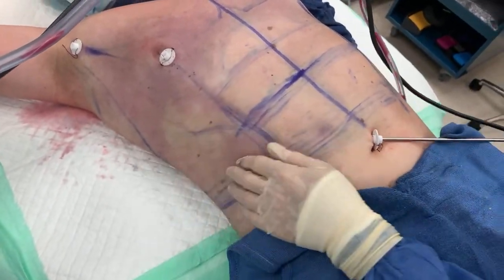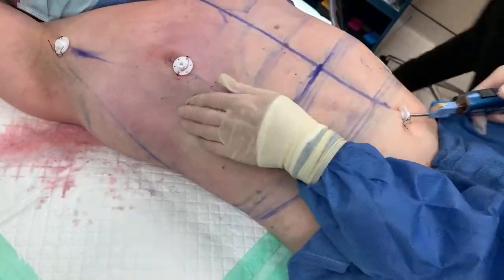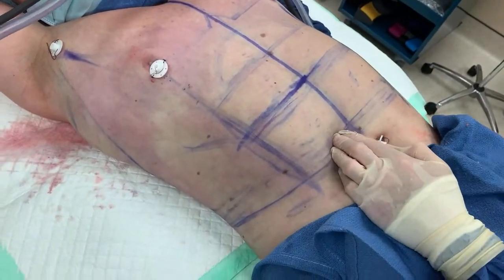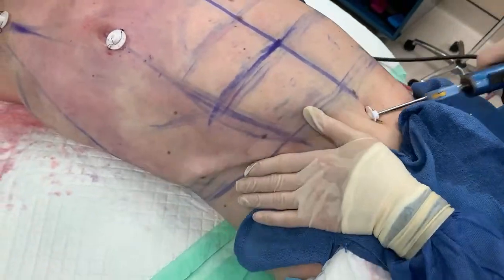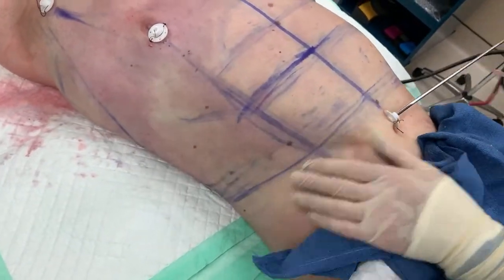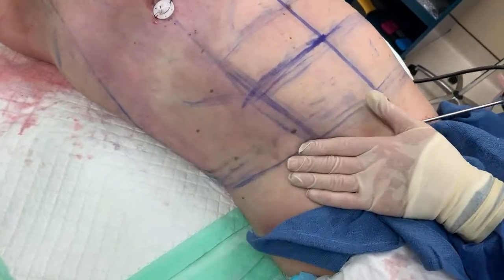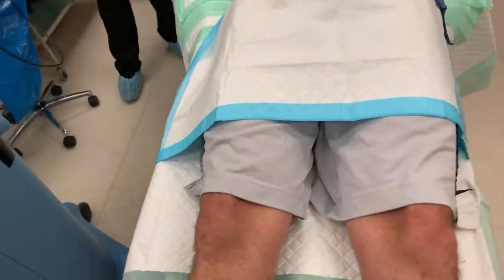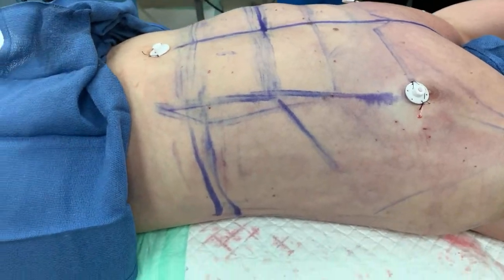That is beautiful — that looks really nice. The bottom, let me shift a little bit more out. Go a little bit on the sides here. Go down here a little bit — you're not quite as numb. I'm just trying to smooth things down. You look great — it's a great candidate for this. We started at 12.5, we were at 16 — so that's 400.